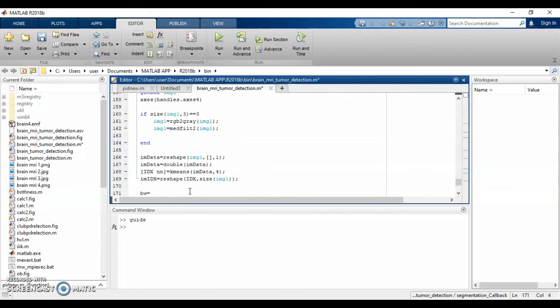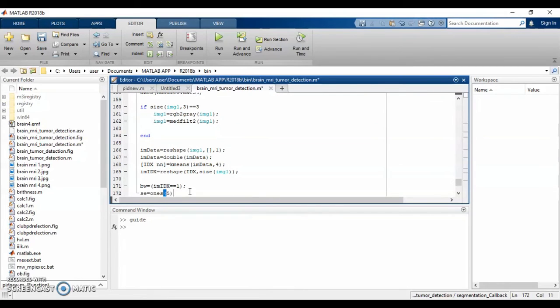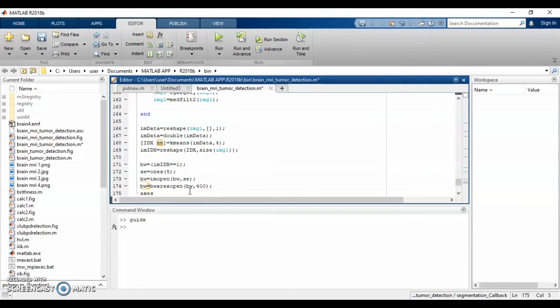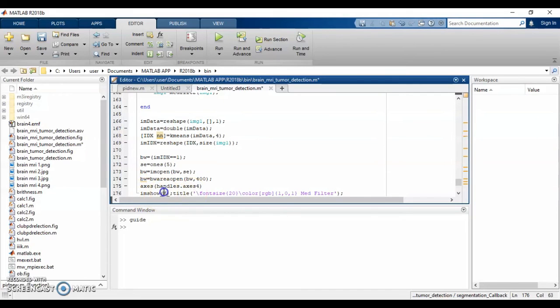The goal is to find certain groups based on some kind of similarity in the data, with the number of groups represented by k. So in this algorithm, we will use a morphological operation tool, which is the opening operation as seen here, and then we will label the image as segmentation.